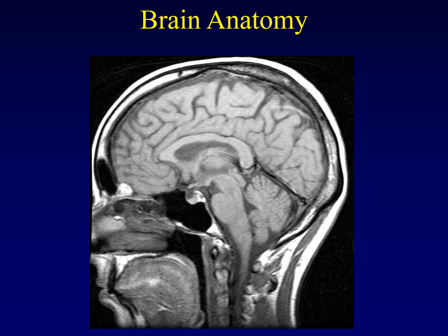Now here's an advantage of MRI, its multiplanar capability. So we're going to take a sagittal midline image and we're going to do the same thing here. Look at some anatomy that shows up best on the sagittal image as opposed to the axial images. We don't get to do this in CT, it's just MRI.